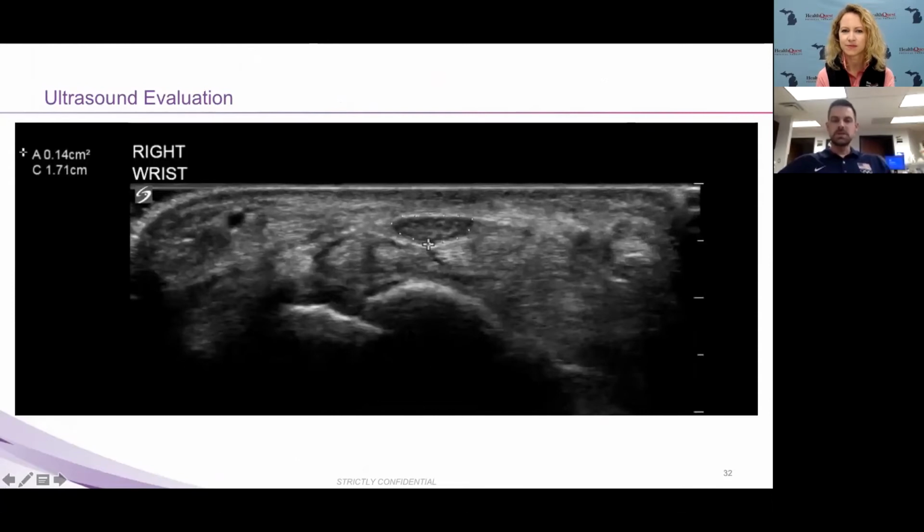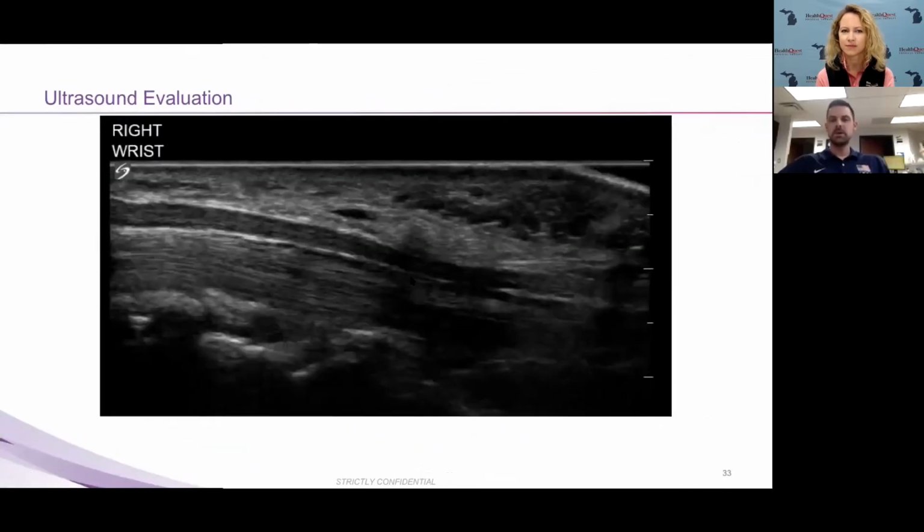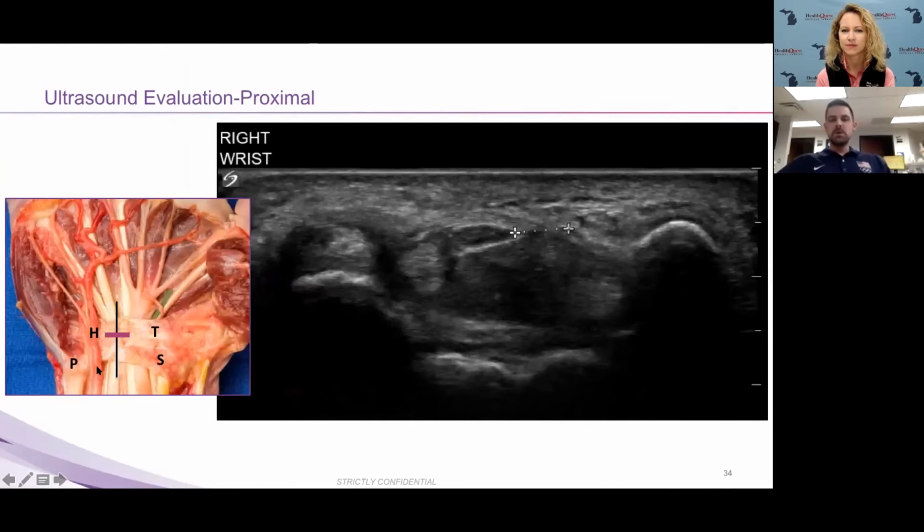So looking with the ultrasound, we're measuring the median nerve at the distal wrist crease. We're getting enlarged cross-sectional area. We're getting that notch sign when we look on the long axis view. And then we want to measure, how much room do we have? So here we're looking again proximally between the scaphoid and the pisiform. And so this is our proximal safe zone, right? Between the median nerve, and then here's the transverse carpal ligament, and then there's the ulnar artery that's actually radial to the pisiform. So you have, somewhere in the realm of a 0.5 centimeter to 1 centimeter of space.